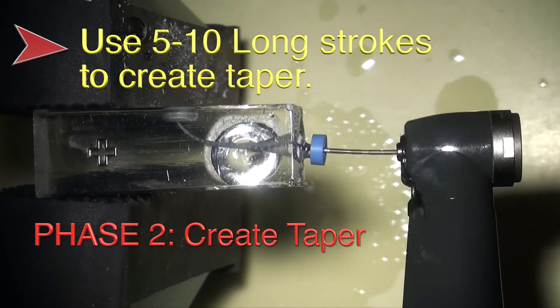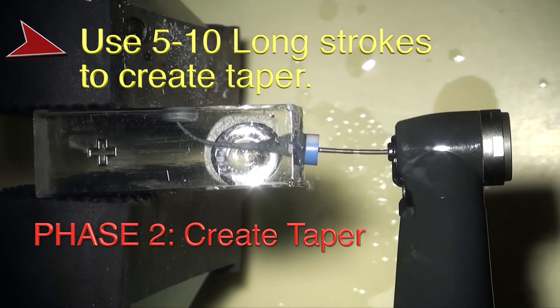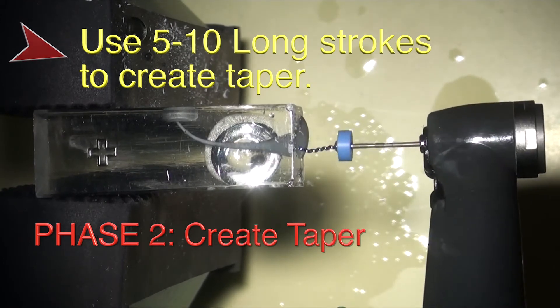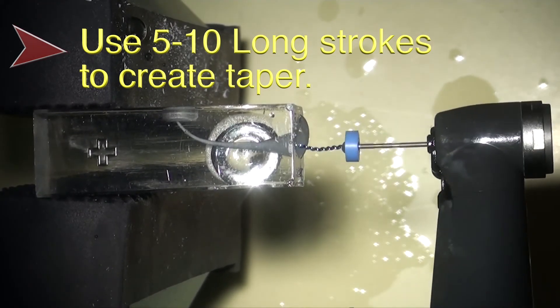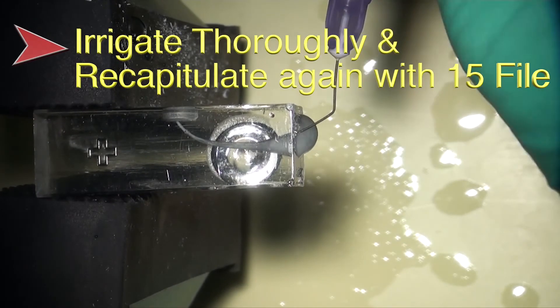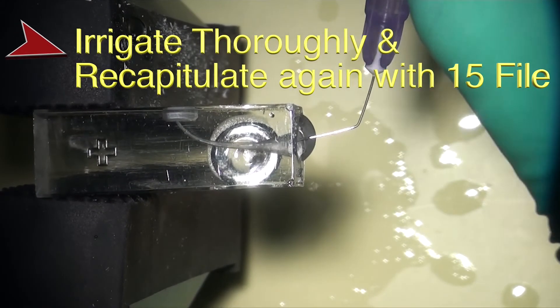You want to use five to ten long, gentle strokes all the way down to working length. Generally, every ten strokes will increase the taper two degrees. So, once working length is initially achieved, ten strokes will get us to a 30-04 in tight canals.